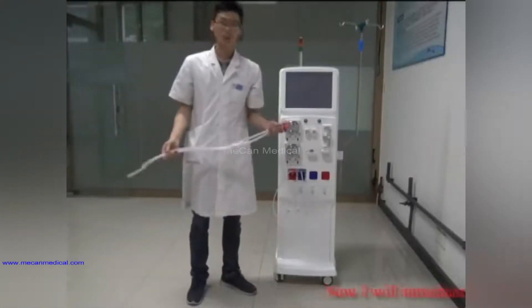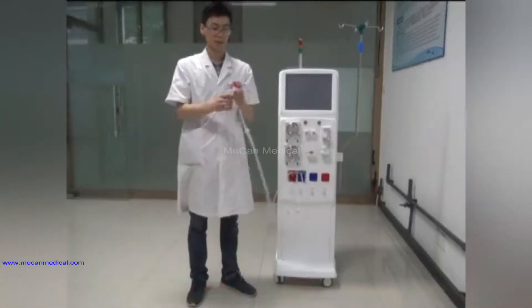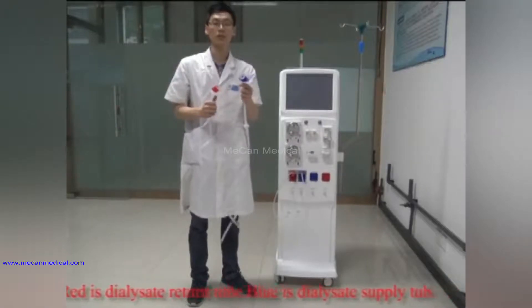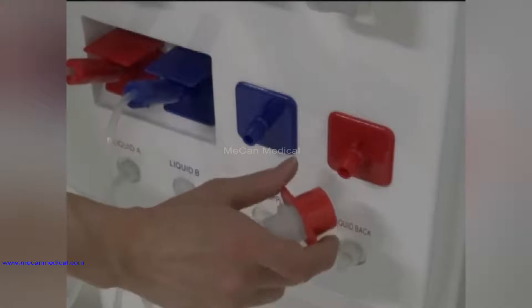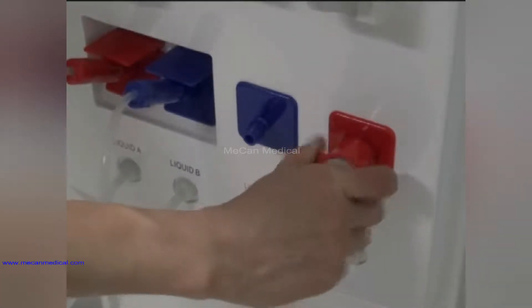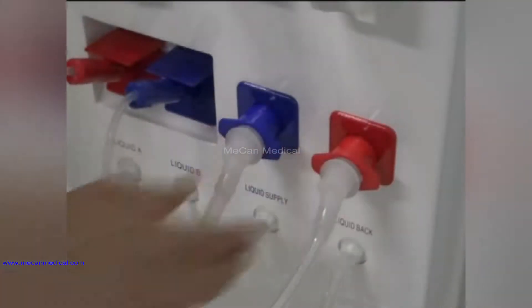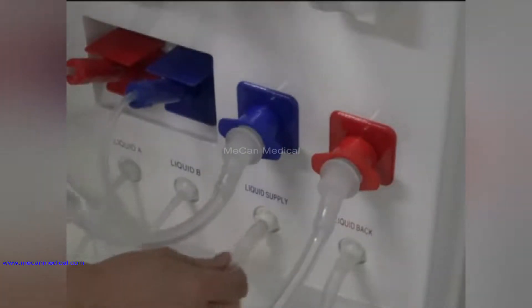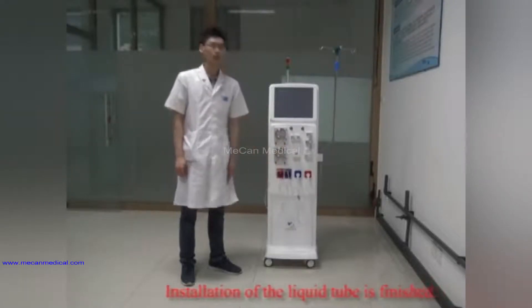Now I will introduce you the installation of the dialysis supply and return tube. Red is the dialysis return tube and blue is the dialysis supply tube. Installation of the liquid tube is finished.